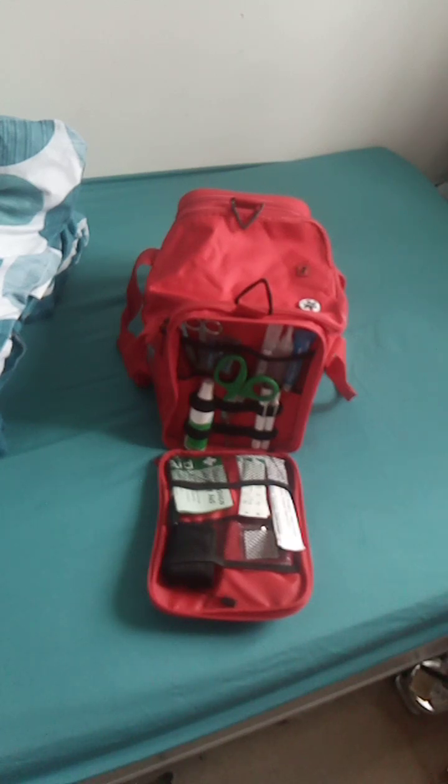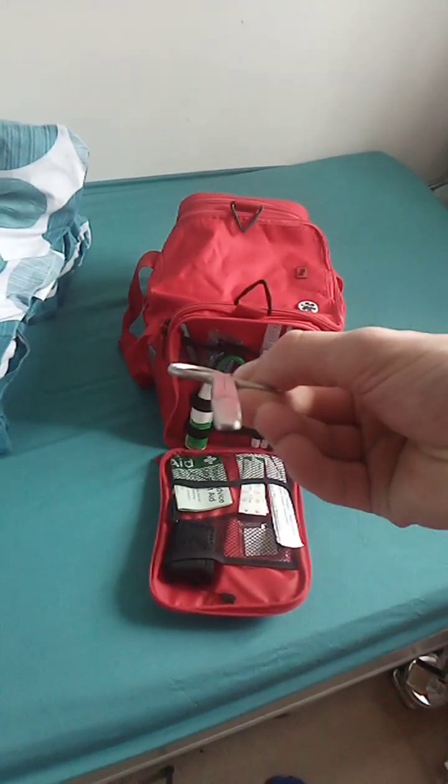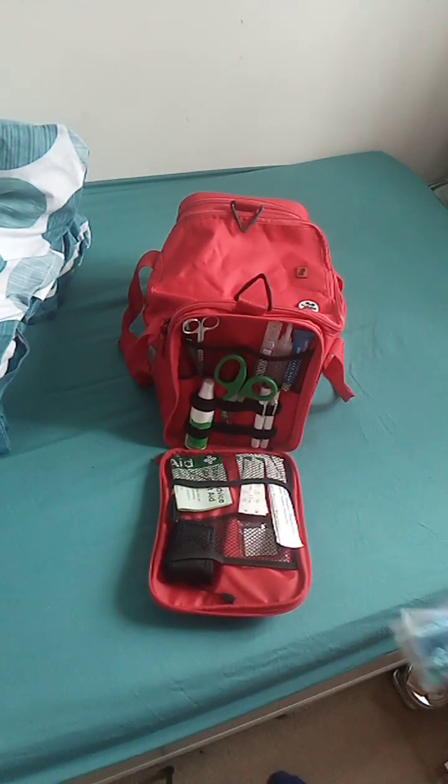Welcome back to Part 2 of First Aid with Adam, Episode 2 - a Level 2 first aid kit. So we just finished with the pen light. We have some blunt nose scissors - as you can see, blunt nose. I will do another video of how to use some of this equipment.